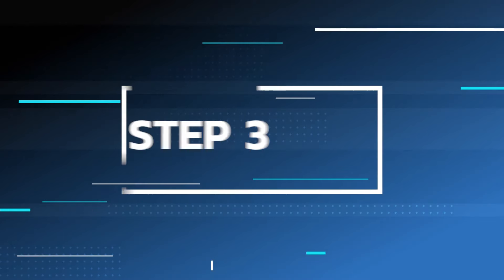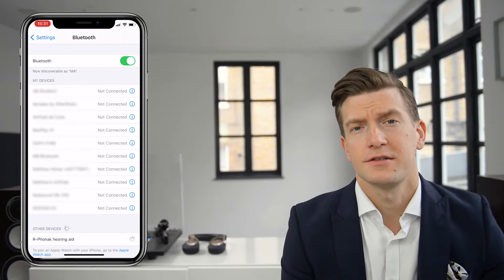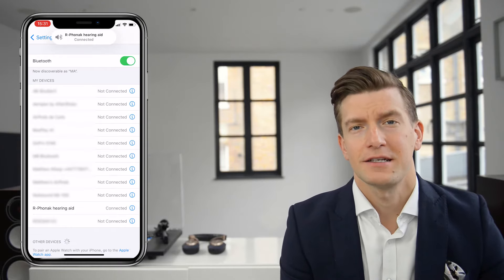Step three: the model of your hearing aid should then appear on screen. You'll only see one side listed, so don't worry if you don't see two hearing aids. Click on that and you should be instantly connected.